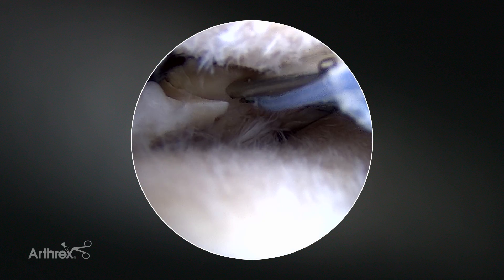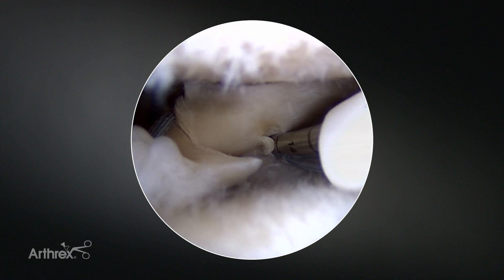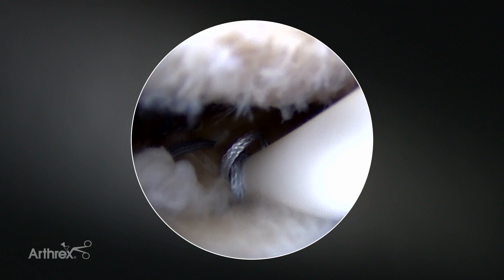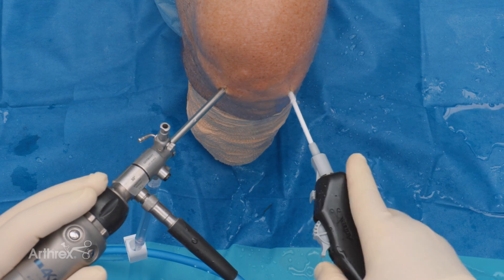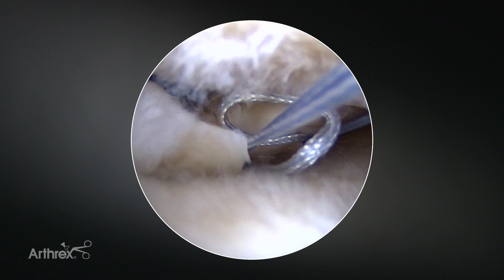So this is the reverse. With this, the initial puncture is through the meniscus, and then the second puncture is out completely underneath the meniscus into the capsule. And you can do this on both sides of the tear if you want — we'll just show it on one here. Same thing, even undersurface, set it.